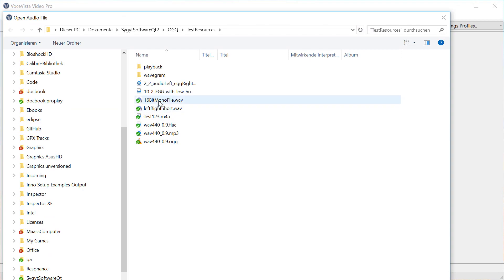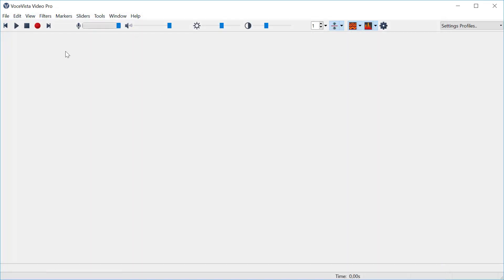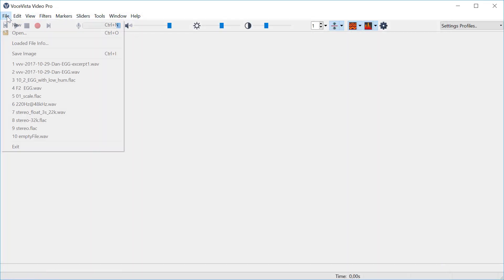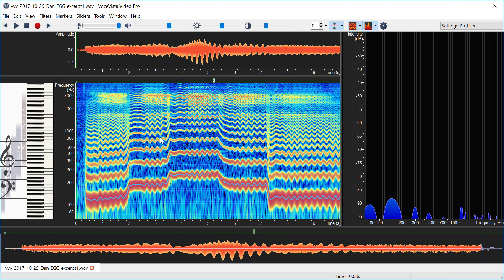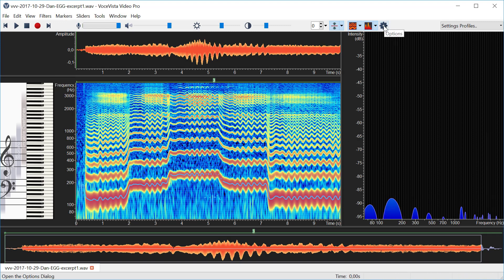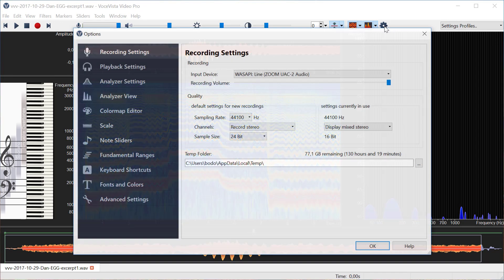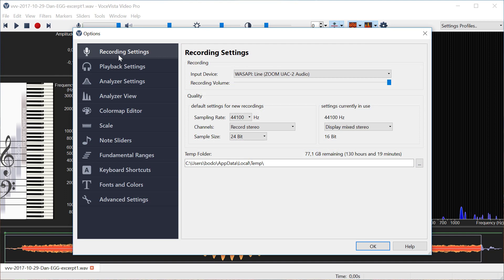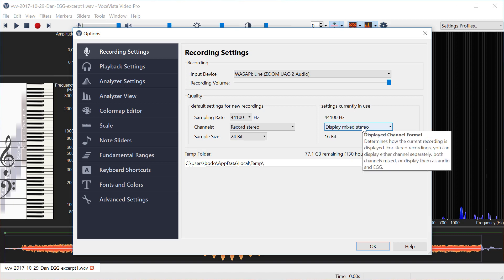I'm going to start by opening a test file that contains audio data and EGG data. And the first thing I want to do is go to the recording settings and look at the channel display. So by default when you open a file that you have never opened before it shows the mixed stereo content.